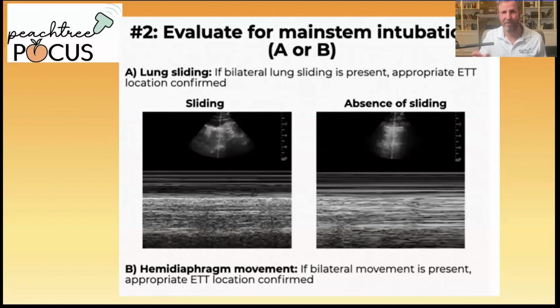There are ways to do that, which include replacing the air in the tube with water, but in my opinion, it's too cumbersome to be practical. So personally, I just wait for the X-ray after that, knowing that at least the tube is in the right place: not in the esophagus, and not in the right mainstem.